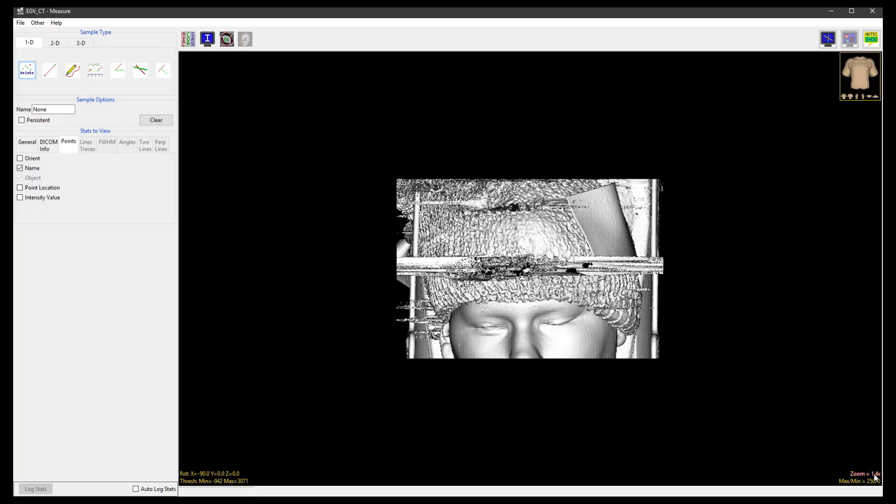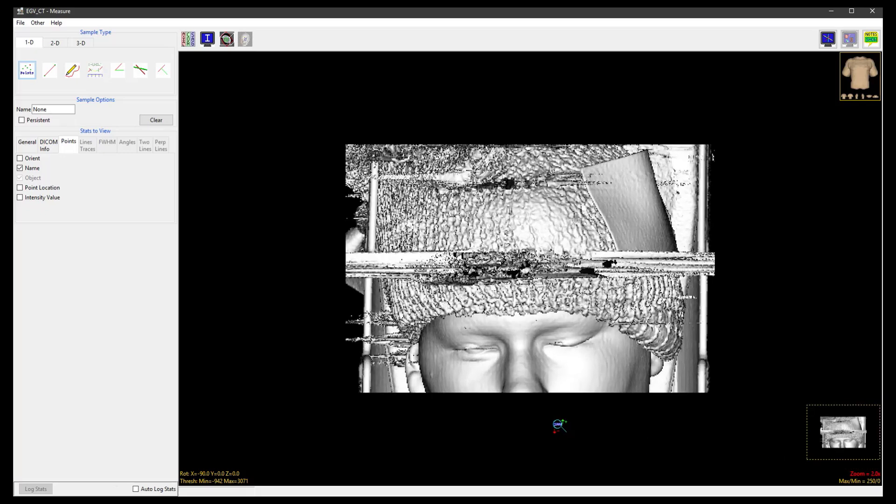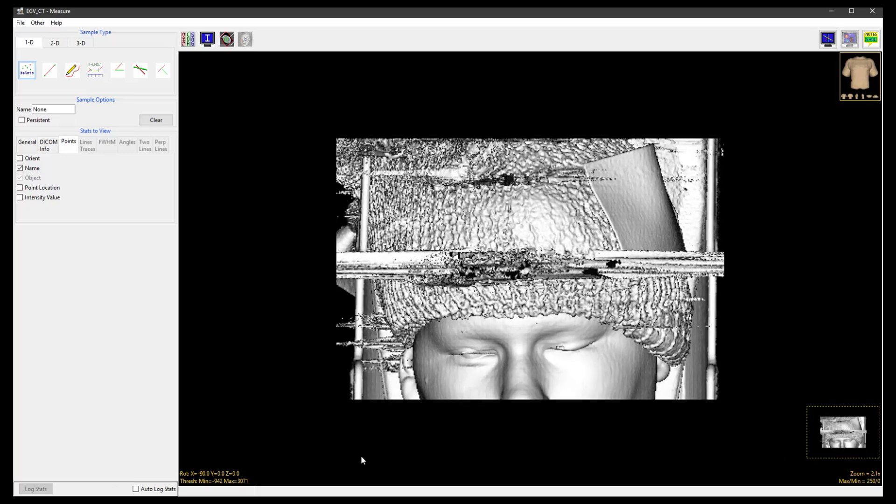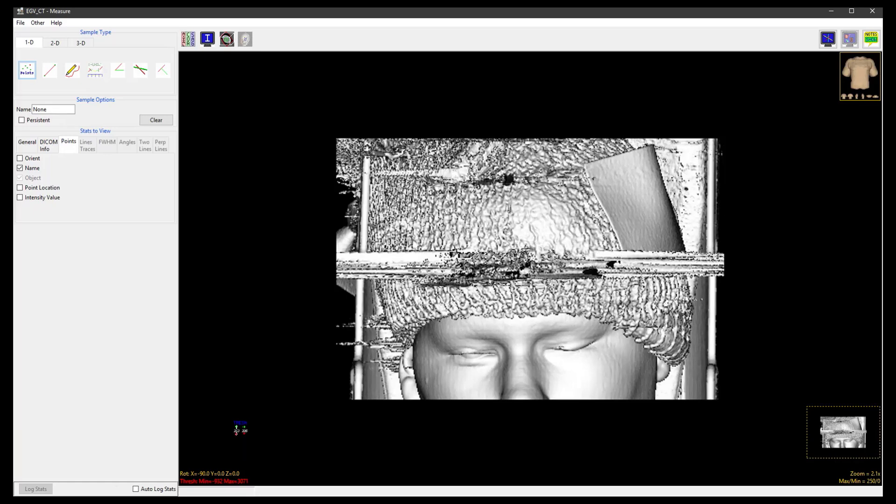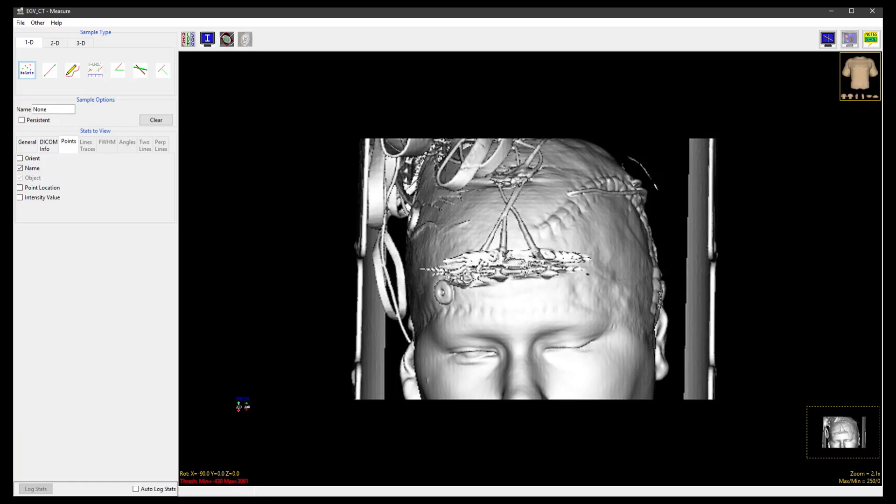Using the Zoom tool, zoom into the rendering and then use the Threshold tool to adjust the threshold range until bone tissue is displayed.